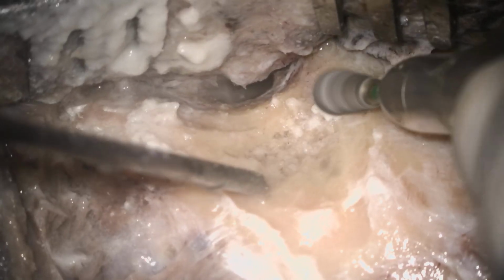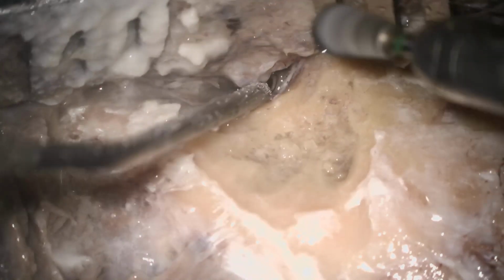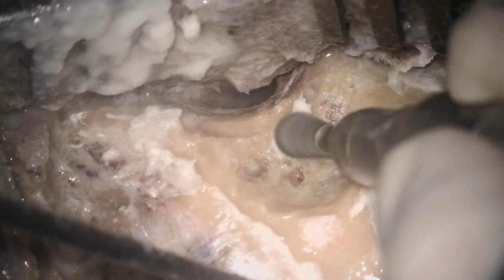This is the cortical bone you are drilling, and look, the honeycomb pattern, the cellular architecture is coming. This is quite a pneumatic mastoid. In the majority of temporal bone dissections we get a pneumatic mastoid, and in some cases definitely very contracted or COM cases, because in the normal population there is some occurrence of COM, and in dead bodies we will definitely get some COM. In some cases we have found the tympanic membrane is perforated also. So this is not very uncommon.